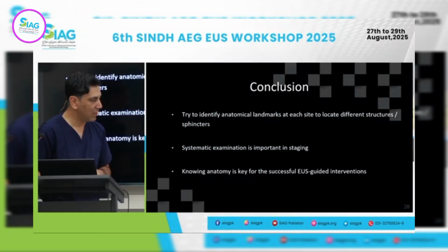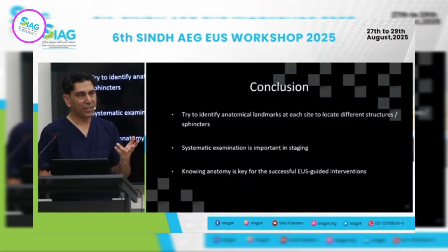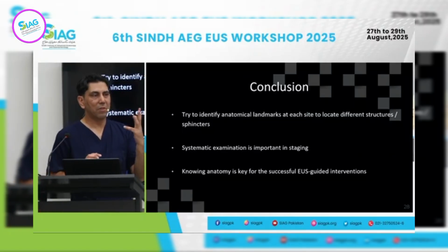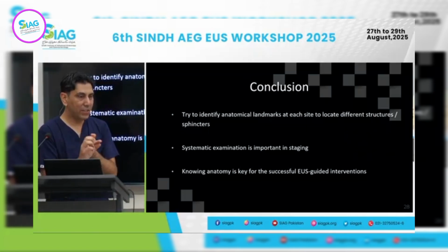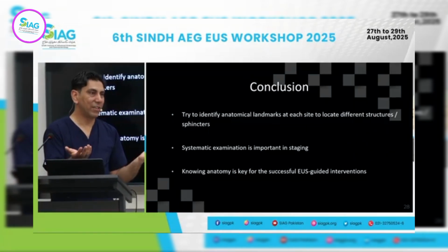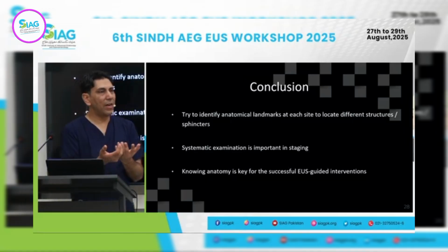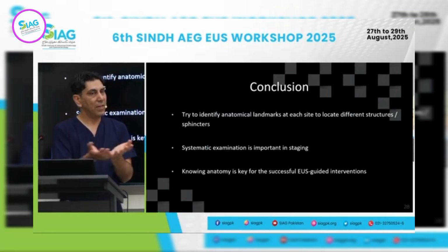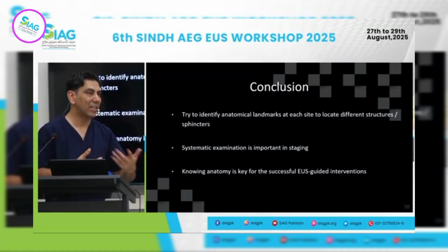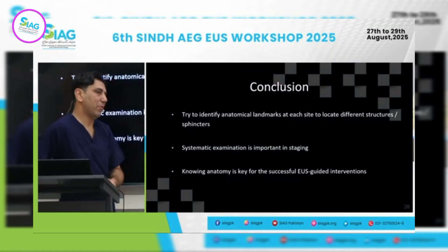Let's see the live demonstration, which may help us understand further. The important thing is, in our practice, the last 2 patients I did before coming here, one was rectal varices, and in the other we did collection drainage of the perirectal collection. That wasn't difficult to identify, it was easy to offer the therapy, and it had a clinical implication. So a lot less diagnostic and a lot more therapeutic.